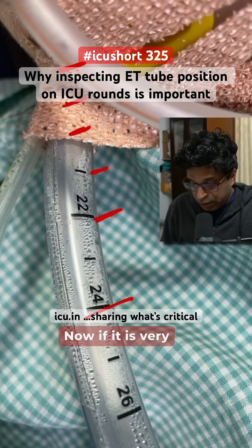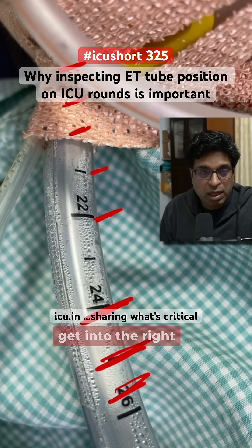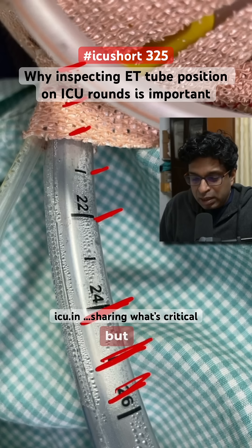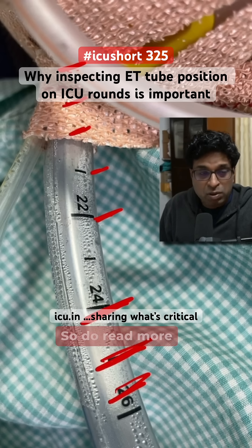If the tube is too deep — like 24 to 25 or 26 centimeters — there are chances it may go into the right bronchus, with no air entry on the left side and left lung collapse. This is a small thing but it can help prevent big complications like accidental extubation and single left lung collapse. Do read more about it.